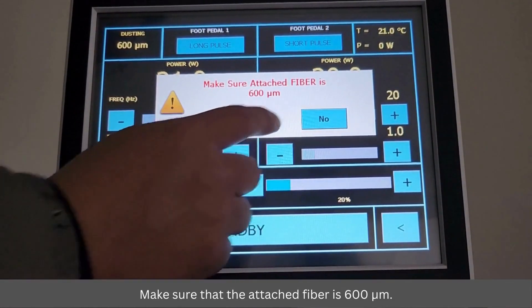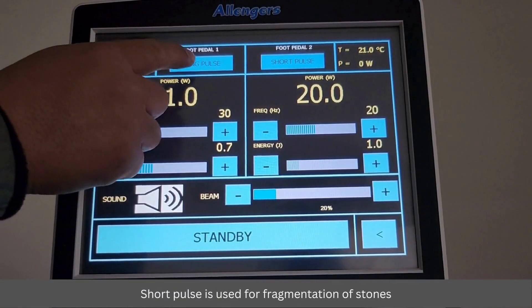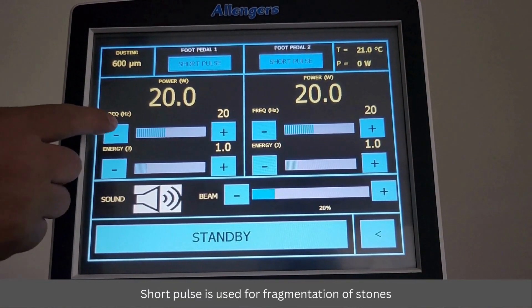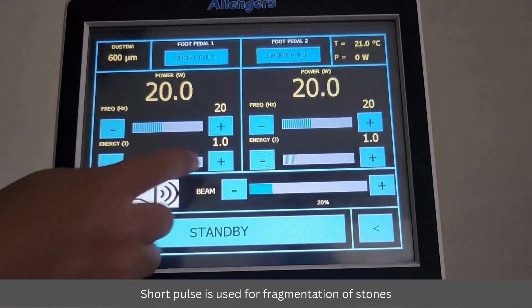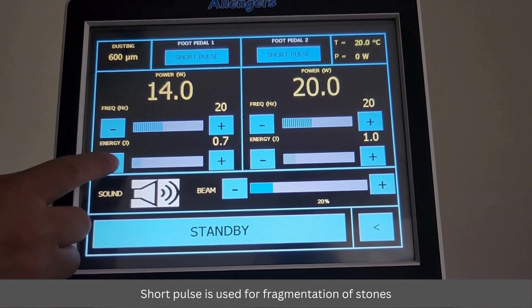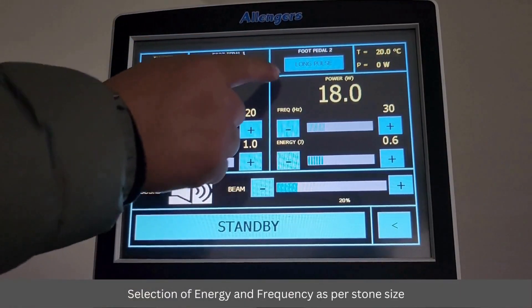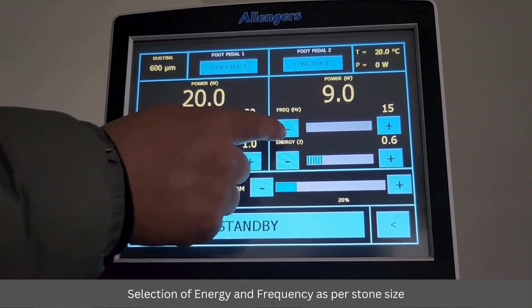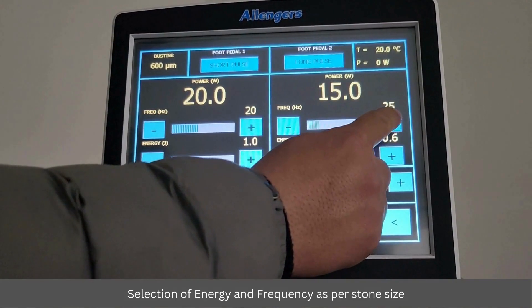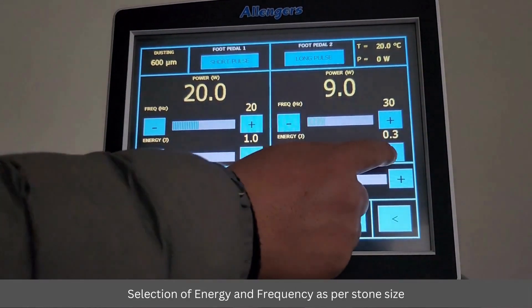Make sure that the attached fiber is 600 micrometers. Short pulse is used for fragmentation of stones. Long pulse is used for dusting of stones.